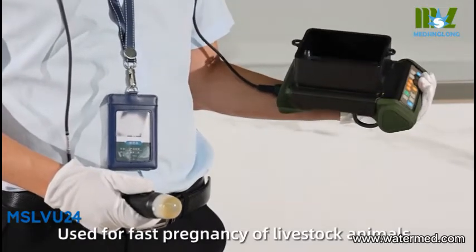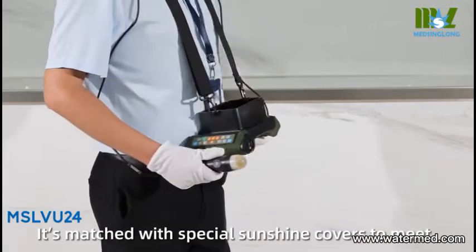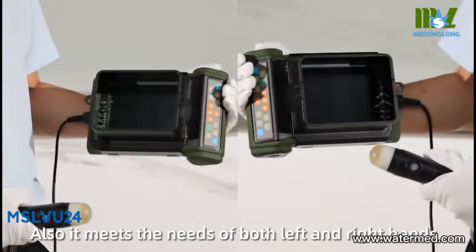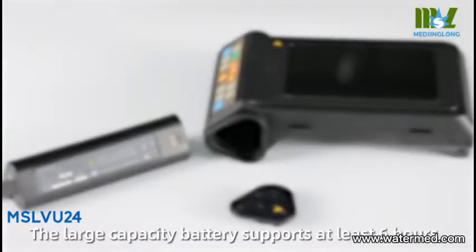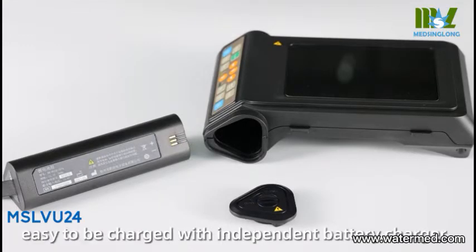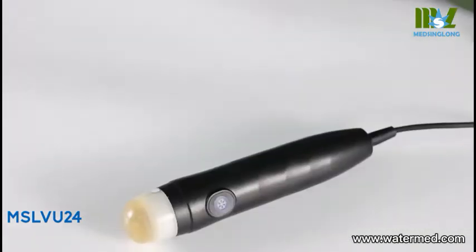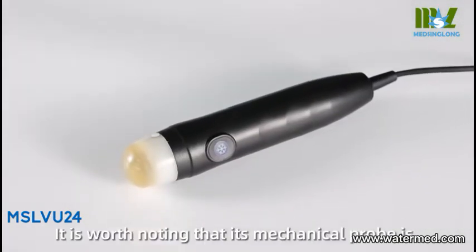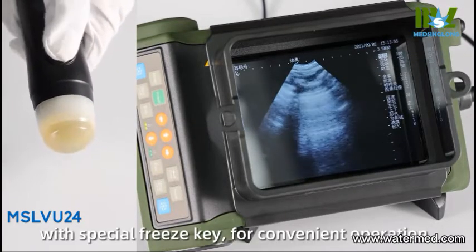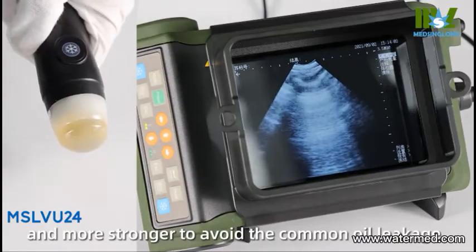It is matched with a special sunshine cover to make outdoor work perform well. It also meets the needs of both left and right hands. The large capacity battery supports at least six hours of use, and it is easy to charge with an independent battery charger. The outer rubber holster is removable for easy cleaning. The mechanical probe offers a comfortable handheld size with a special function key for convenient operation, nice imaging quality, and improved durability to avoid common oil leakage.